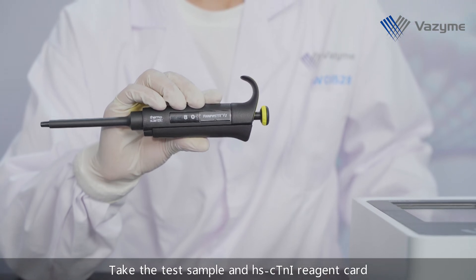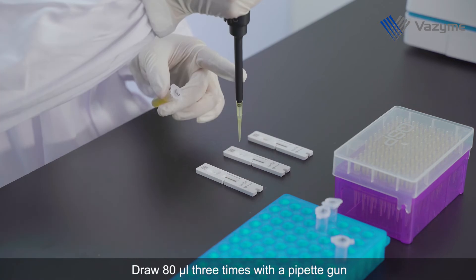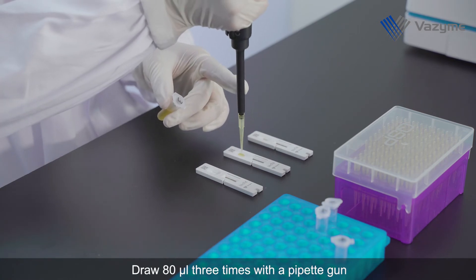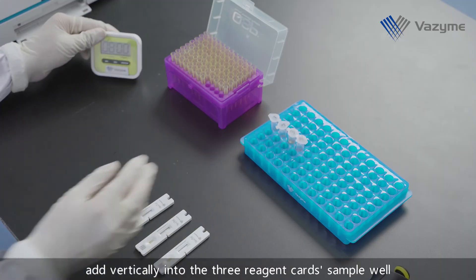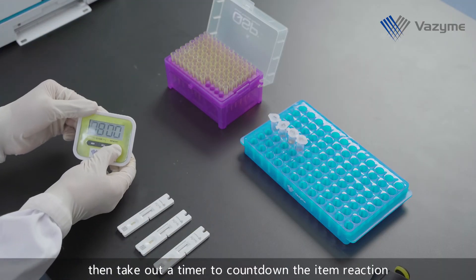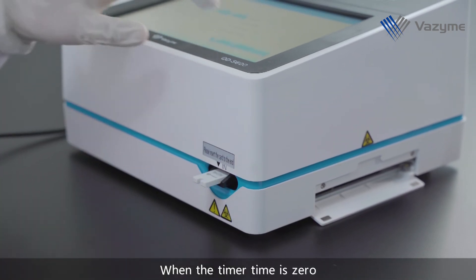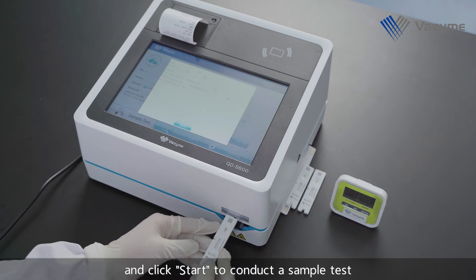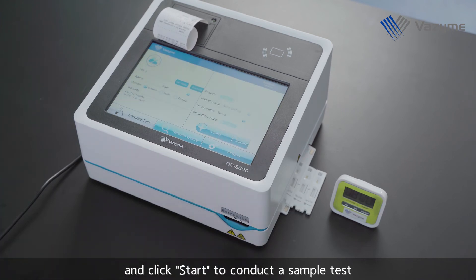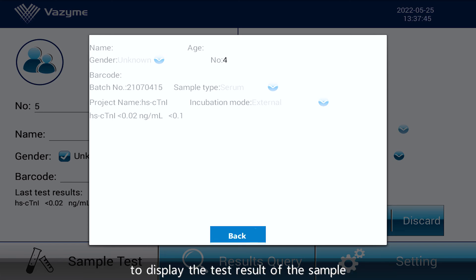Take the test sample and High Sensitivity Cardiac Troponin I Reagent Card. Draw 80 microliters three times with a pipette gun and add vertically into the three reagent card sample wells. Then take out a timer to count down the item reaction. When the timer reaches zero, insert the three reagent cards into the instrument one by one and click Start to conduct a sample test.